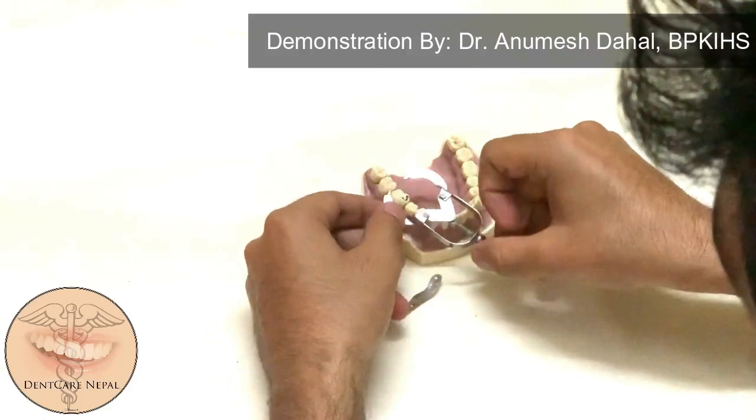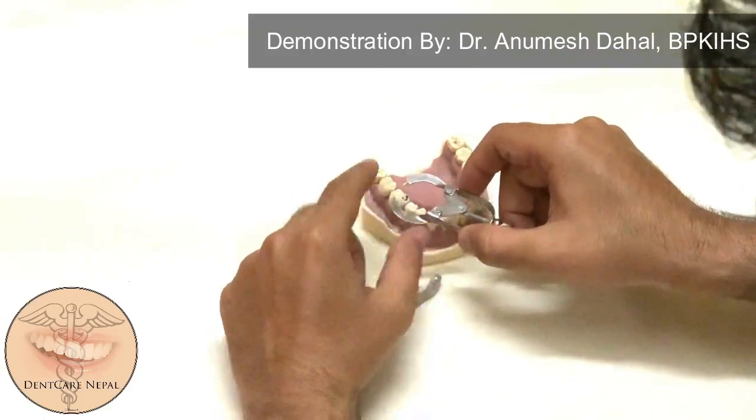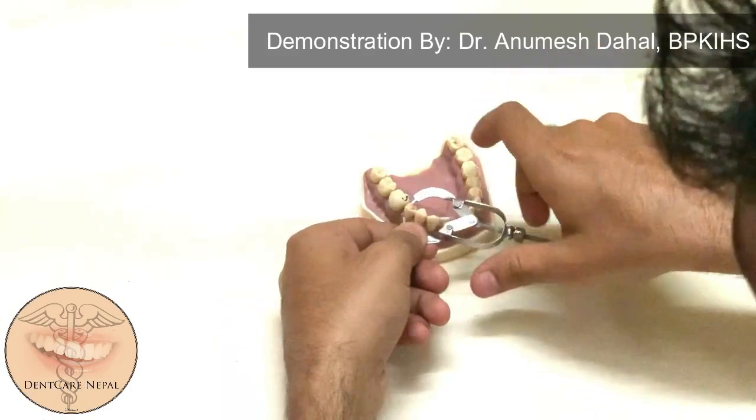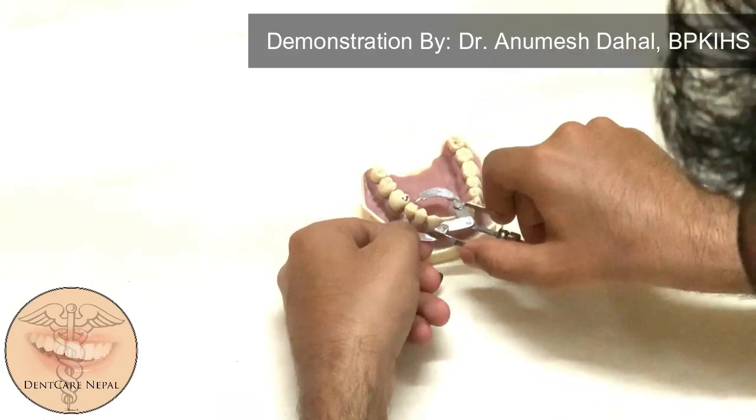The placement of this matrix band should be such that the open end goes below the gingival margin and the screw end should come out of the mouth of the patient.